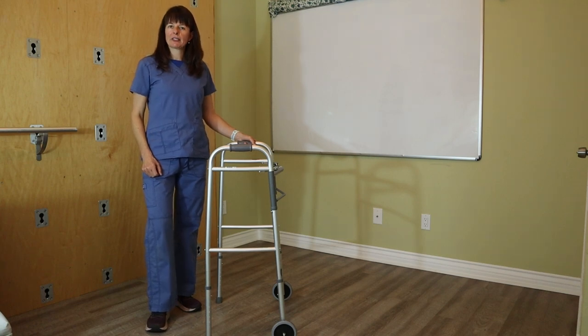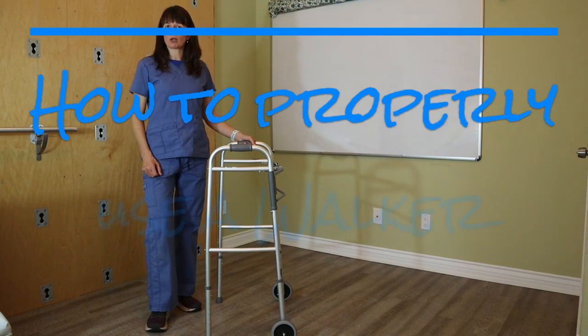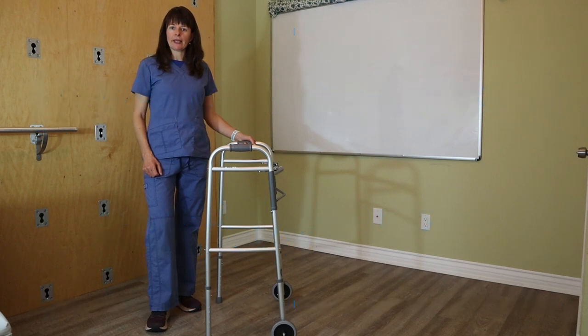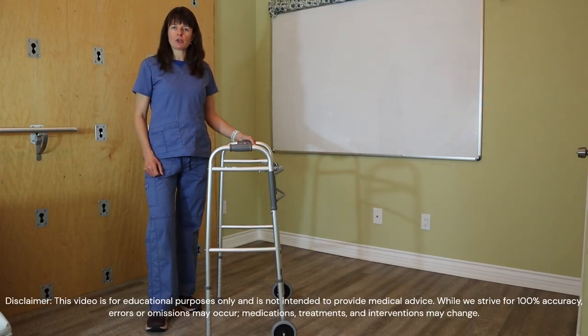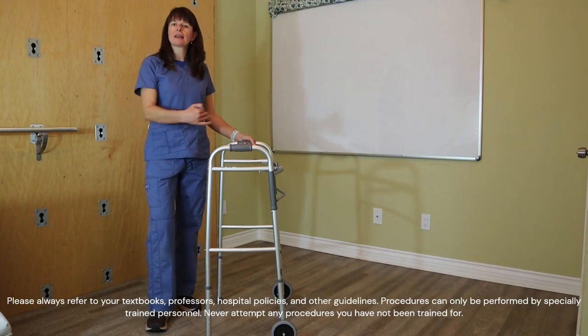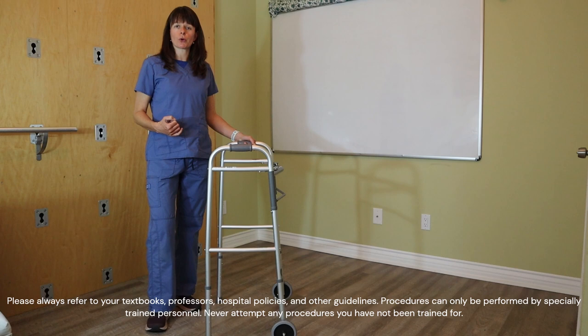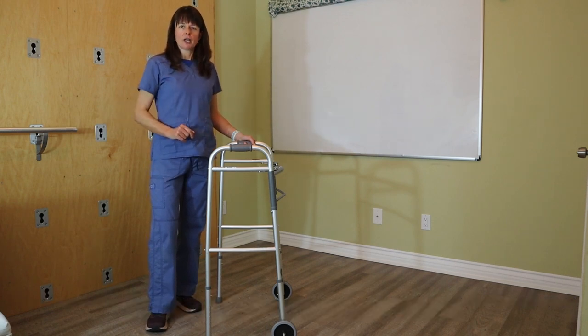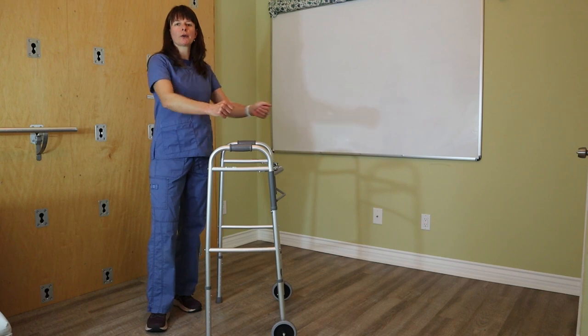Welcome to Nursing School Explained, in this video on how to properly walk with a walker. We already went over the sizing, and we just need to make sure that the patient uses the walker and moves it forward as their body moves forward, in a very smooth fashion.